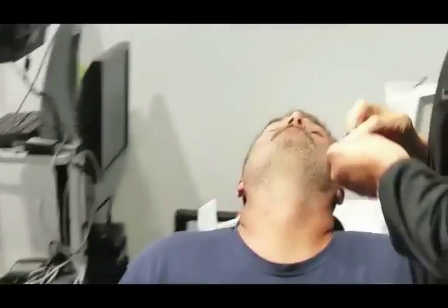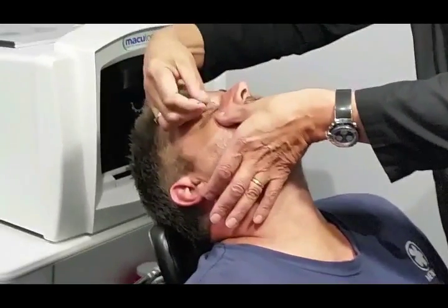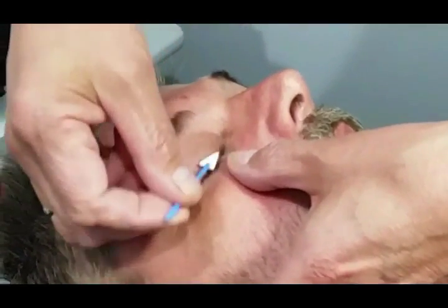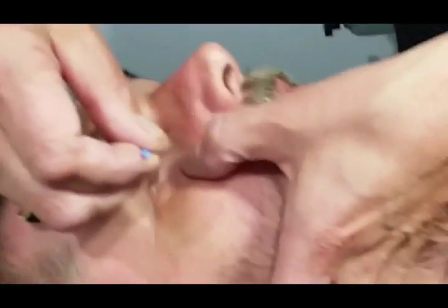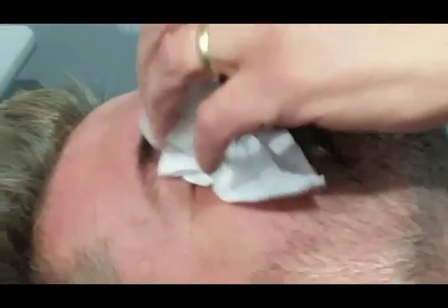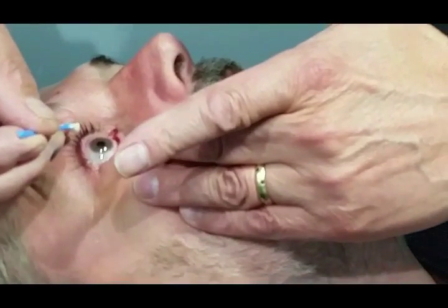Many individuals who use amniotic grafts use forceps to restrain the lids during the procedure. We have found that hand-holding is a lot more comfortable for the patient and a lot easier to control, so we have two individuals involved — one to hold the lids and the other to apply the graft and contact lens. Here we're drying the eye with a Weck-cel sponge, and now we're going to hold the lids back through the remainder of the procedure.